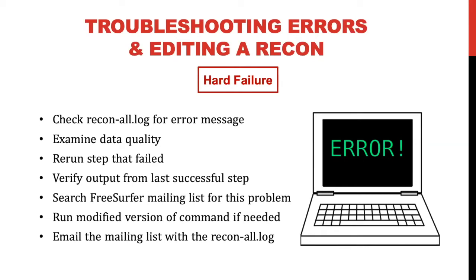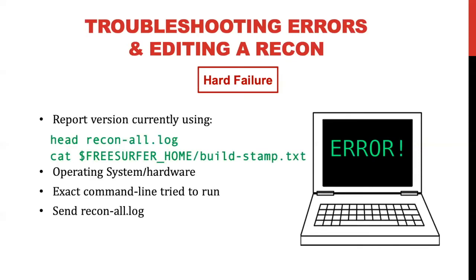As well, you can run a modified version of your command if needed, or you can send us an email with your reconall.log file. When you do send us an email, please provide the reconall.log, as I mentioned so many times, as well as your operating system and hardware, as well as the exact command line that you tried to run. This will help facilitate communication between our lab members and your team.